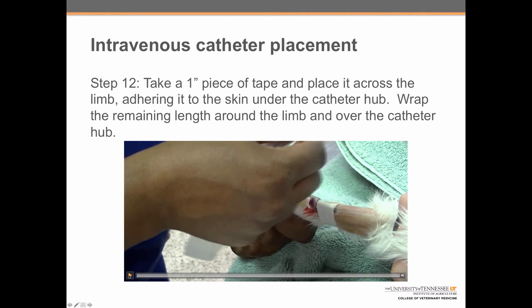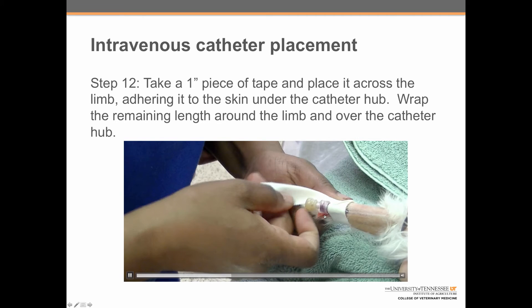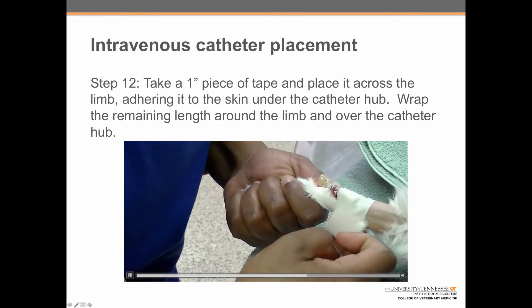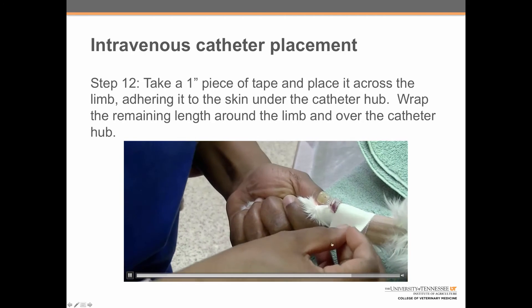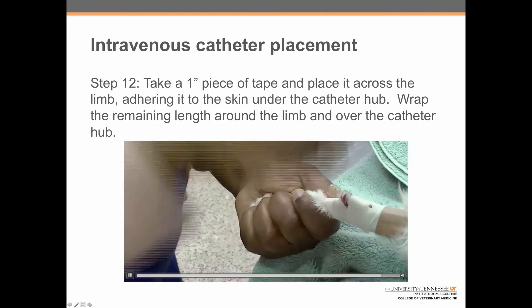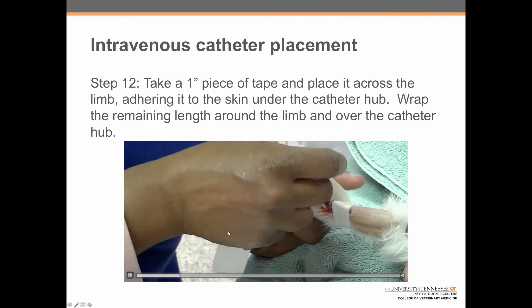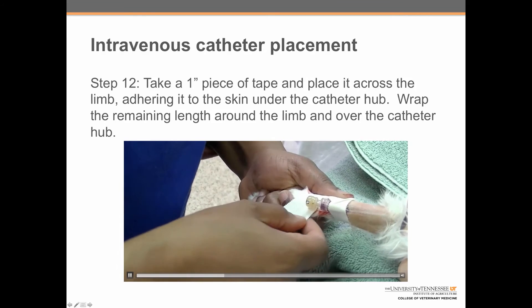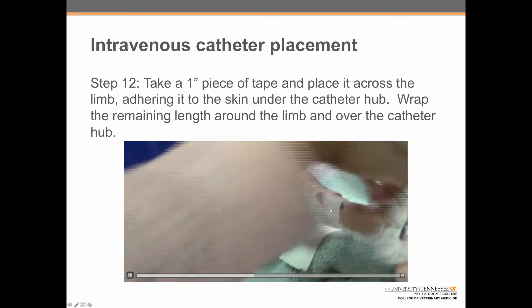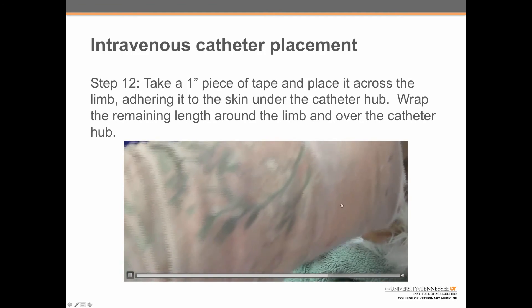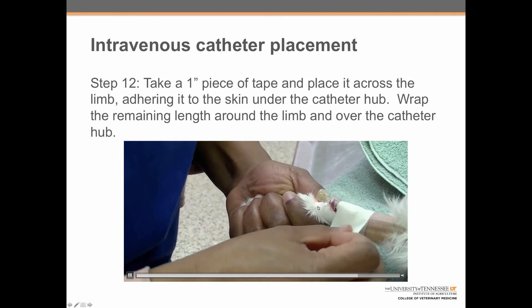Step 12: take a one-inch piece of tape and place it across the limb, adhering it to the skin under the catheter hub. She slides the tape over any blood to get the hair out of the way, then wraps the tape around the catheter site to secure it. The tape is slid under the injection port and over the fur, then wrapped across over the top to securely hold the catheter in place.